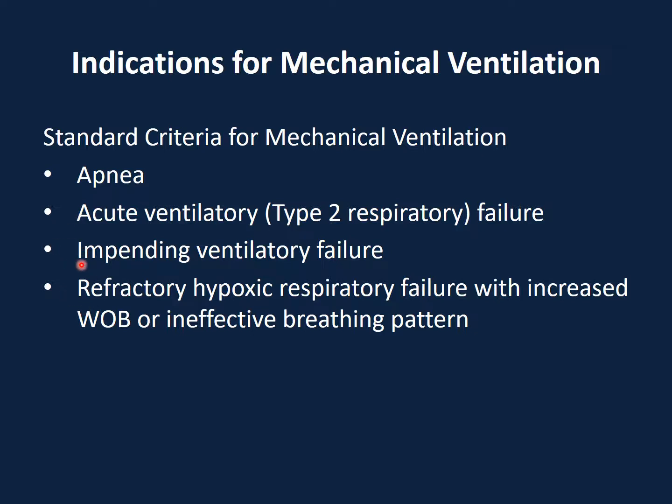So this is one consideration. The last part refers to refractory hypoxic respiratory failure or refractory type 1 respiratory failure. Now, refractory means when you are providing oxygen therapy, the patient is not responding. So the saturation is not coming up. For some reason, you give 100% oxygen through a non-rebreather mask, the oxygenation is not improving. So therefore, mechanical ventilation may be needed, in order to provide the pressure to open up some of the alveoli and therefore increase the gaseous exchange surface area for oxygen to get through.